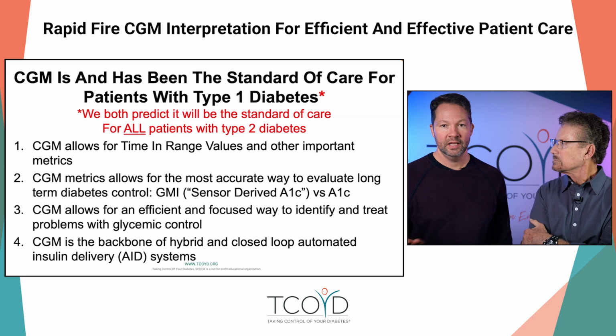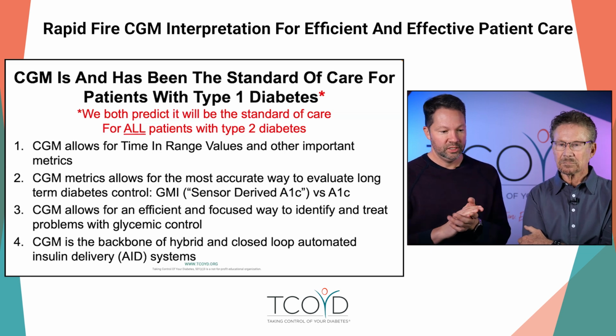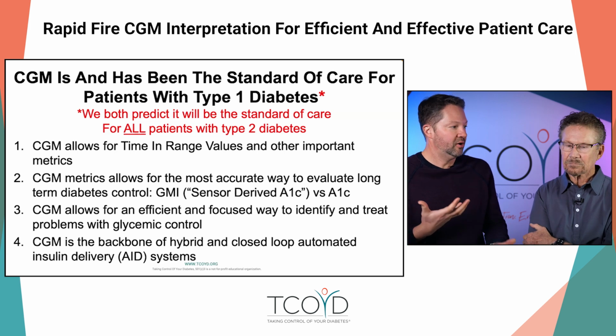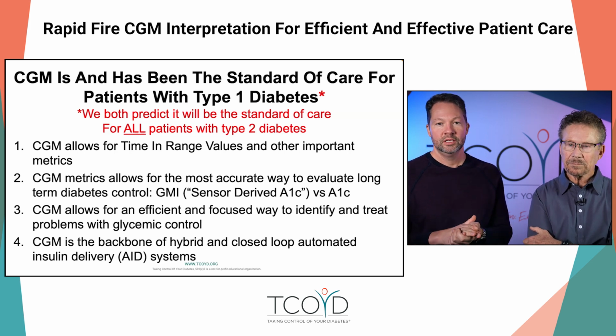It's weird to even say that we were forced to do these virtual visits. And I think because of that, a lot of the clinics were forced to get better at getting this data remotely. So a lot of times now when I see a patient, especially if it's a remote visit, their downloads will be available the day before, certainly before the visit. So I always have that information. I can look at it, get an idea of what I want to talk about, what I think are the main things before I even see the person.